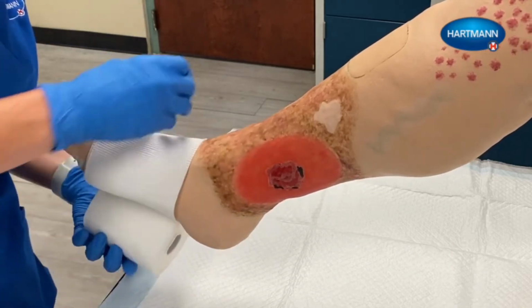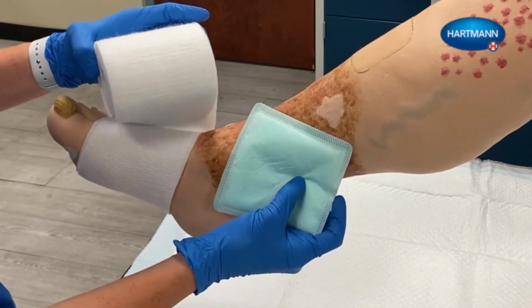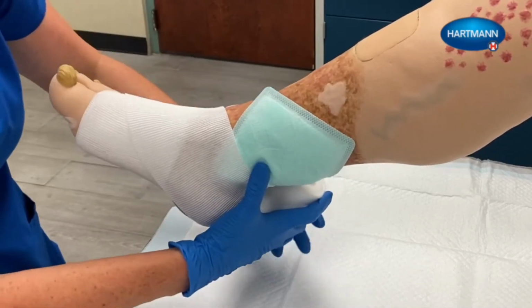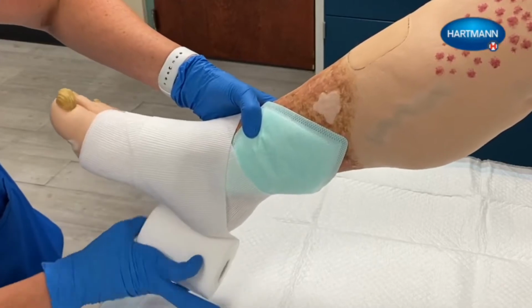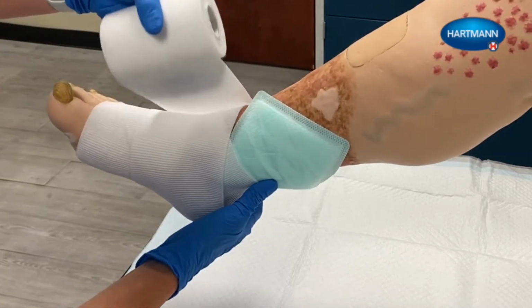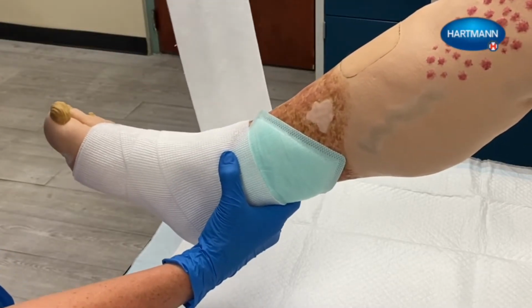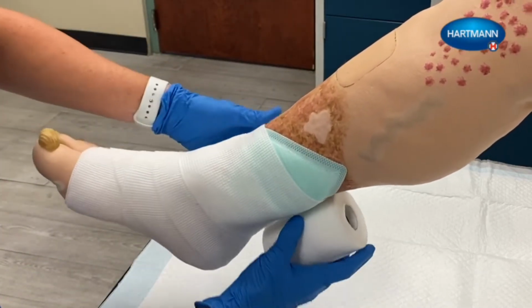After 2 turns for fixation, plantar, from medial to lateral to support pronation, wrap across the back of the foot and enclose the heel using a figure 8. Wrap the foot without stretching the bandage. On the lower leg, wrap the padding bandage around the leg using a spiral technique with 50% overlap, keeping it at full stretch. This may have to be adapted to the patient's anatomical and pathophysiological characteristics.